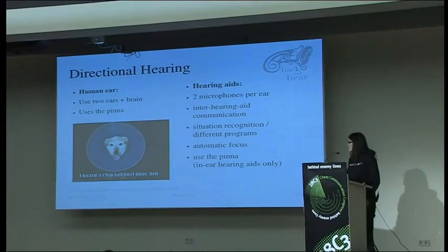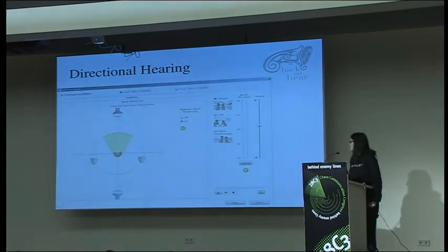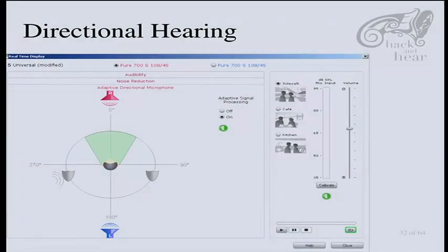The in-ear hearing aids I showed before can of course still use the features of the pinna. This is also a screenshot from the tuning software. You can actually test your directional hearing in real time, so you can wear your hearing aids connected to the software, and then do something like that and see if it's recognized correctly. It works more or less in a silent room, but not in a cocktail party.